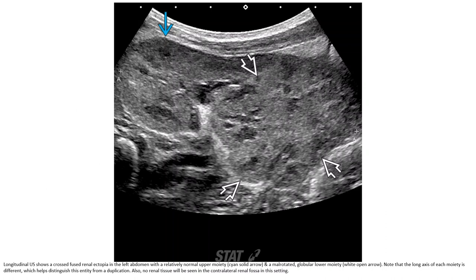The left abdomen shows a relatively normal upper moiety and a malrotated, globular lower moiety. Note that the long axis of each moiety is different, which helps distinguish this entity from duplication. Also, no renal tissue will be seen in the contralateral renal fossa in this setting.